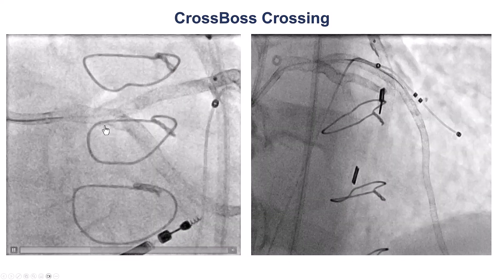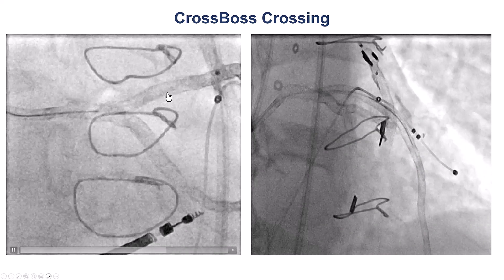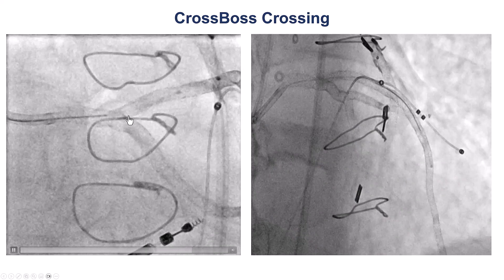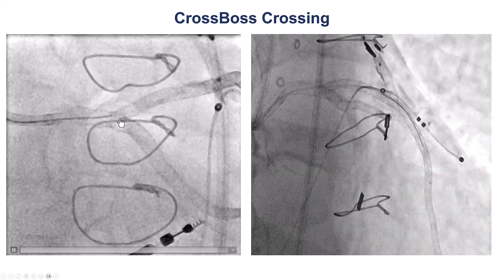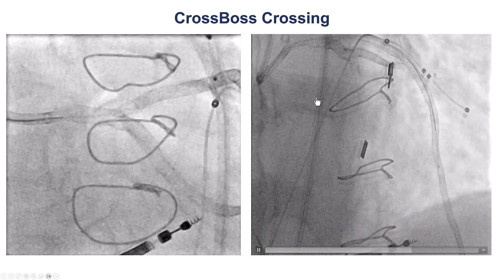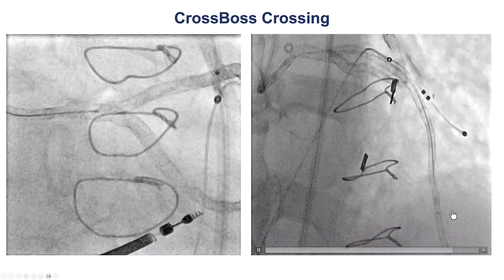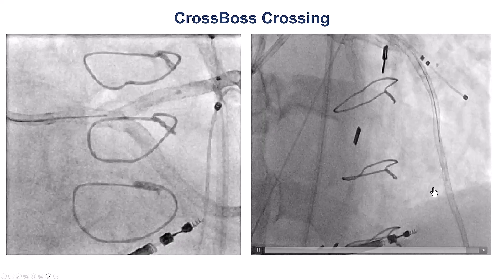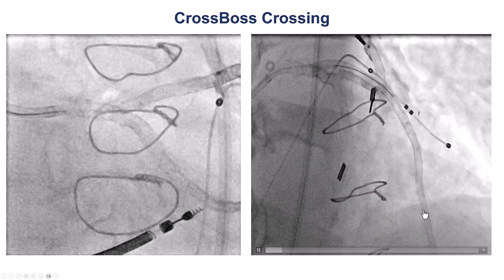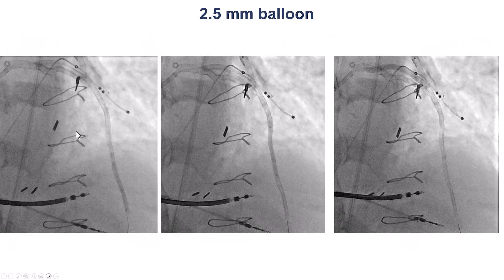So we used the workhorse wire to advance the CrossBoss all the way into the LAD. And then with a fast spin technique, we were able to rotate it, and the CrossBoss advanced nicely inside the LAD stent. And then we were able to cross into the distal true lumen.